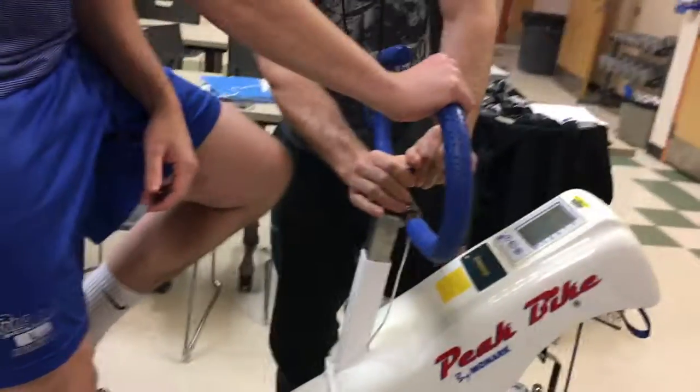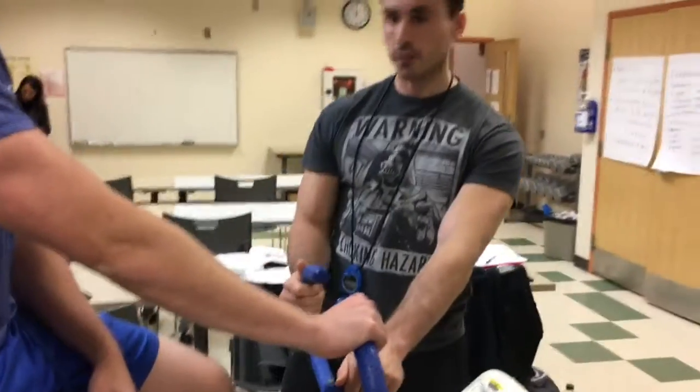Before you actually get started with the test there are a few things. One, you're going to need to designate two people to be counting revolutions. They'll be counting revolutions every five seconds and calling it out to a data recorder. The data recorder is another position that you need, and then a timer. For the sake of this demonstration, I'll be doing the timing and we don't need to worry about recording any data.